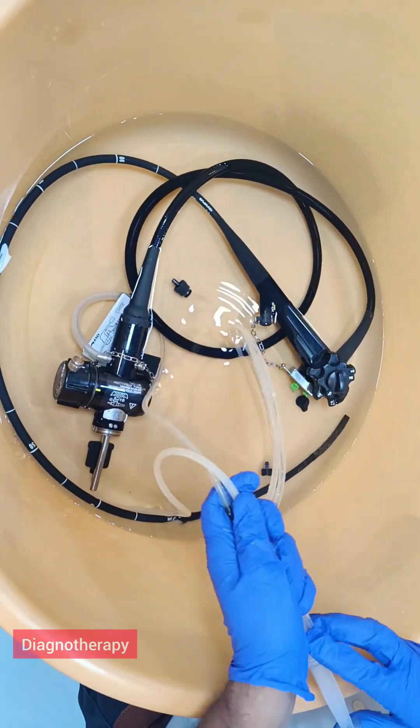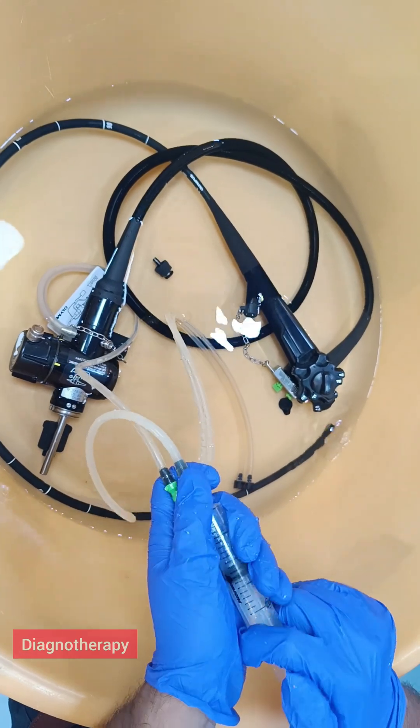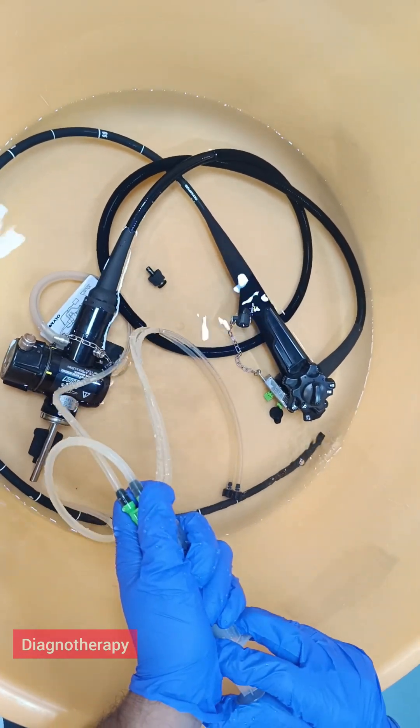You need to repeat this for proper cleaning. You can see air bubbles coming out from the end of the scope.